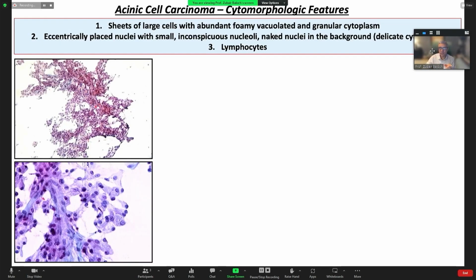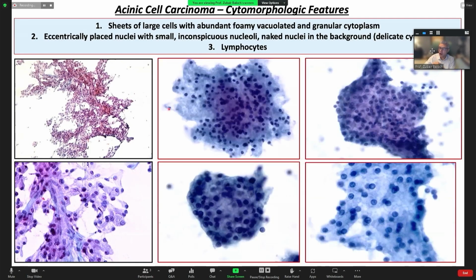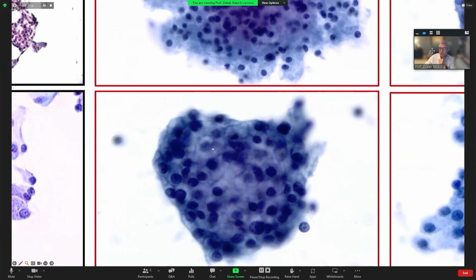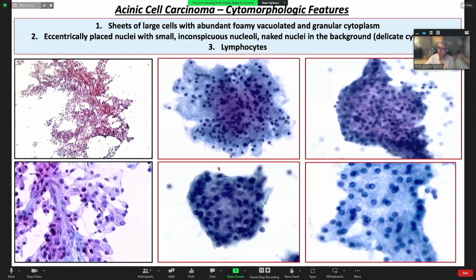This is a tumor of acinic cell carcinoma, which is showing, again, that monotonous cell population. They can have this very papillary arrangement, and you can see these beautiful vessels coursing through them. On Pap stain slides or on ThinPrep, you may just see this mass of tumor. But what I want to point out is this very important finding that you will see these beautiful sharp cytoplasmic borders and this really kind of fried egg appearance, sunny side up egg appearance. So you can see these round nuclei lacking nuclear pleomorphism. But some of these tumors can also be high-grade tumors.